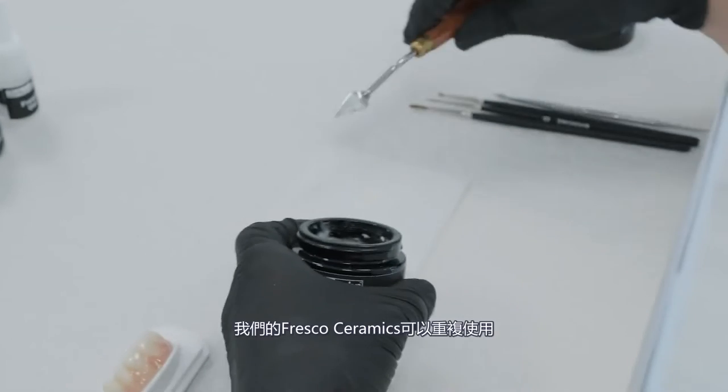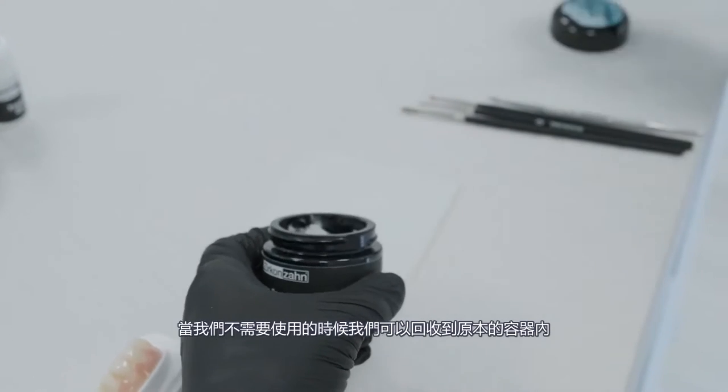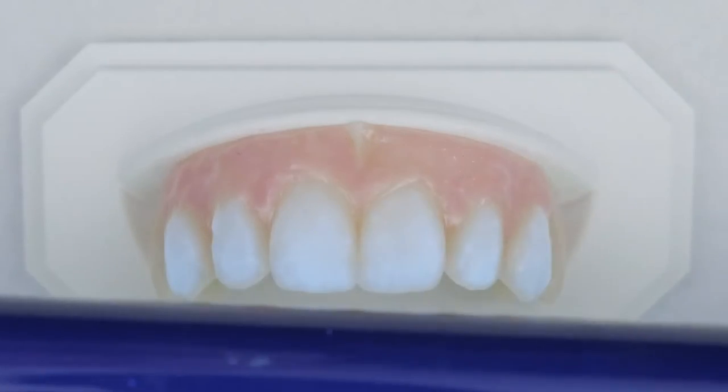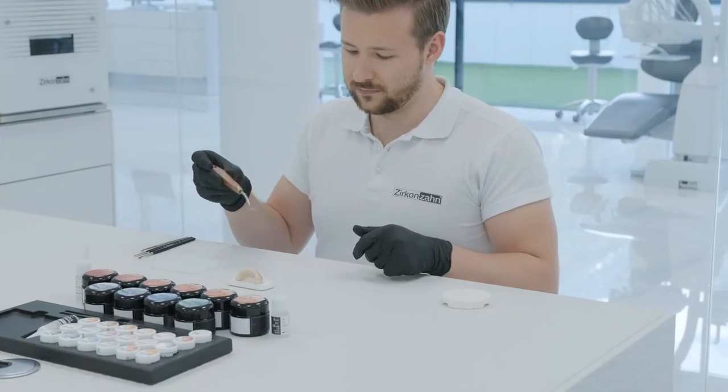Our Fresco Ceramics are reusable — as soon as they are no longer needed, you can put them back in their container. To check if the fluorescent paste has been uniformly applied, we recommend putting the structure under a UV lamp before the first firing.